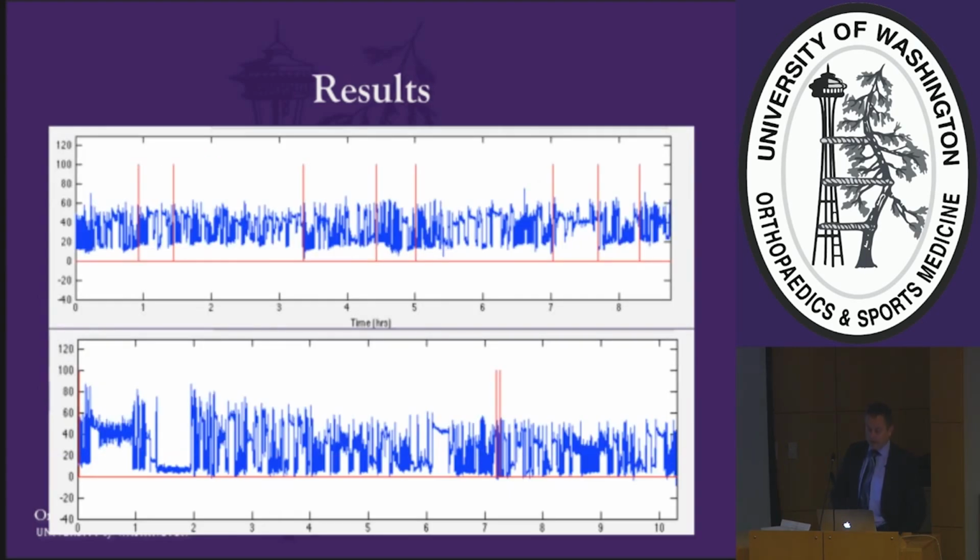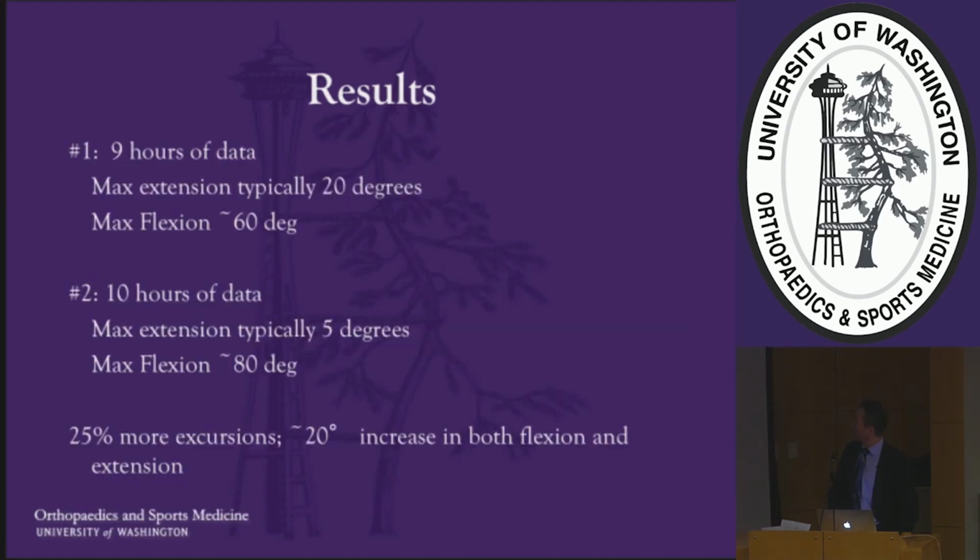So how does this apply to a patient? This is some raw data from a patient at 2 different time points. She's undergone a bilateral total knee. The top section is at 10 days, and the second section is at about 21 days. Don't worry, this is what the machine sees. You don't have to decipher this. But this is the data distilled down.